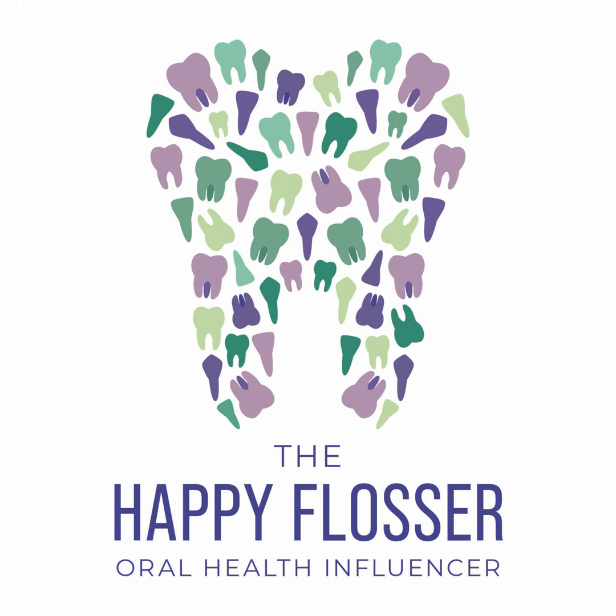Now, let's talk about specific patient challenges. Gagging is the first thing that comes to mind. Some patients will tell you they're a gagger before you've even put an image near them. They warn you that they have a strong gag reflex. And I will say that sometimes patients with a strong gag reflex can let you know whether their gag reflex is stronger in the morning or late in the day, and we can plan according to that information.